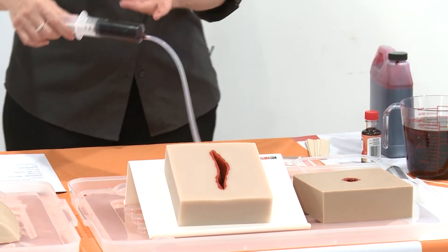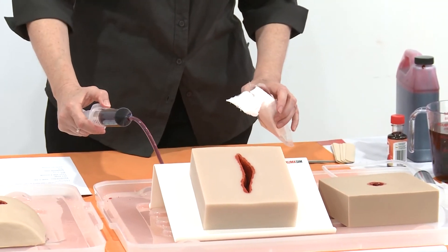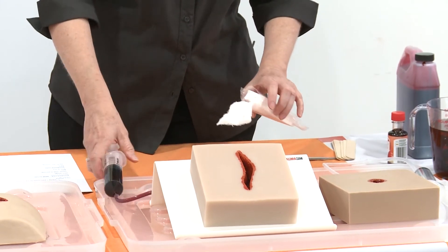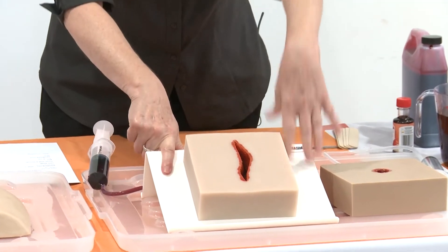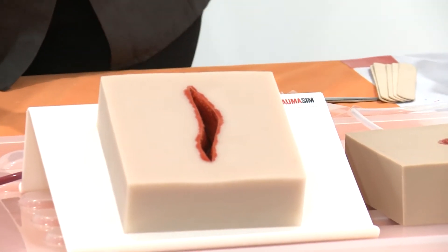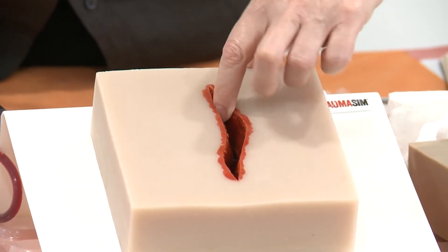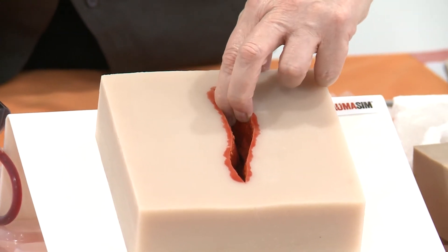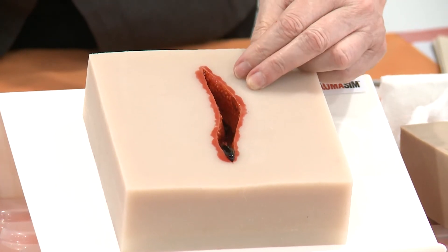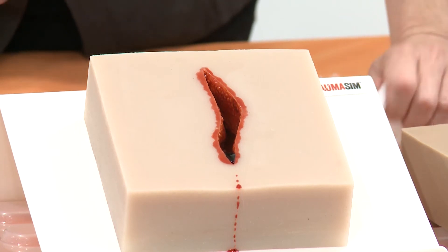This is just a 60ml syringe — a nice easy way to get it into your trainer. We've put this one on an angle just so it's easy for you to see, but we'd normally just sit it flat on the table. It has one arterial spot at the top where it's going to flow out, and we would normally get it started and get it flowing so that the student can see where the blood's coming from.